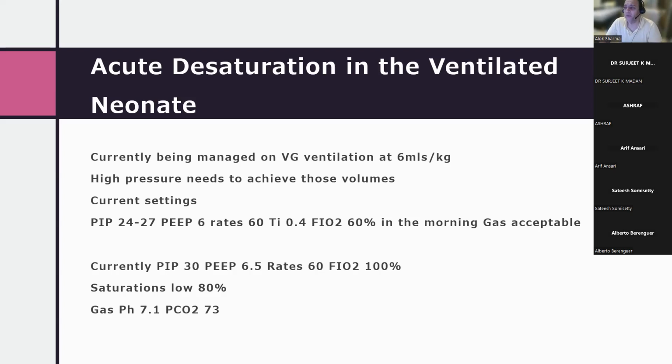So what would you like to do? A lung ultrasound? Yes, definitely. Okay, so just looking for any collapse or consolidation. Avinash, anything else that you would like? Anything in the history or anything that you would like to do that I haven't talked about?